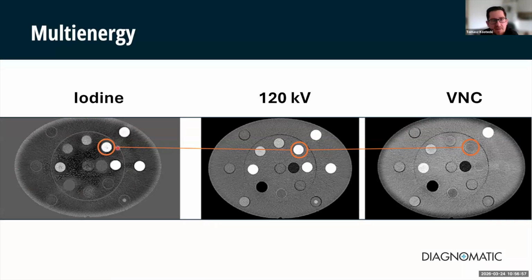As you can see, we have multiple samples in the phantom, and we scan it with the CT scanner, and then we calculate the images.